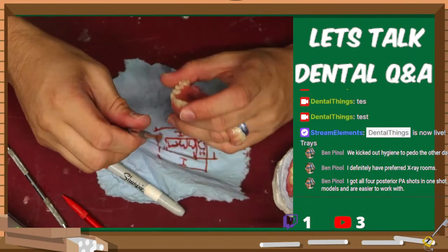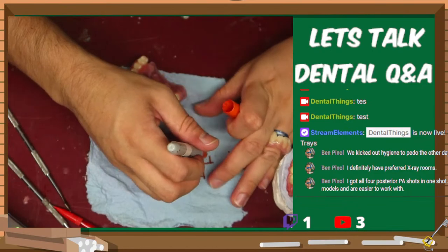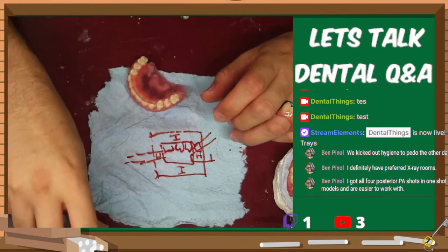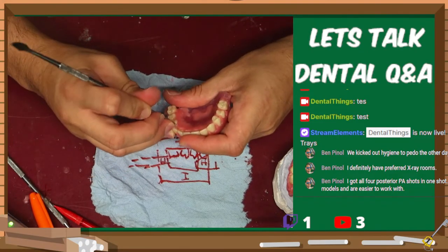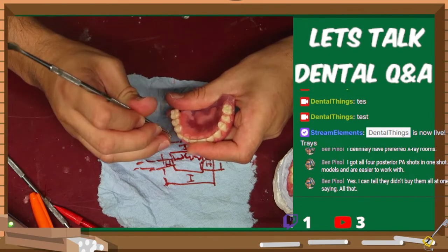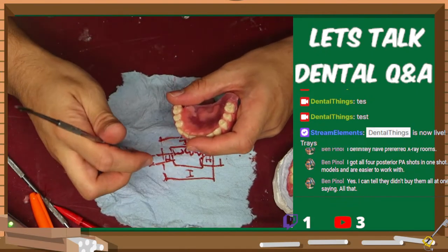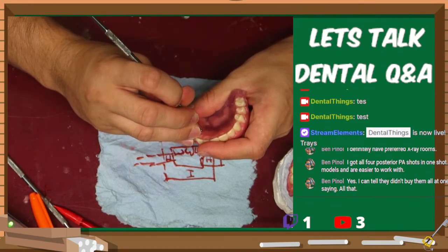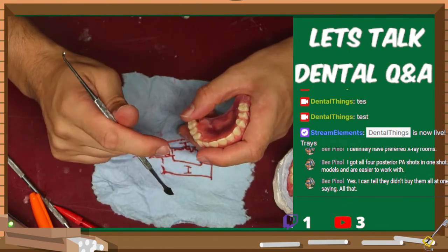And even sometimes just the direction that the wire is facing, because not all of them come straight out the back. Some of them come out at a little bit of an angle, and that makes it easier to grab on with your snap array sometimes. Yeah, I can tell they didn't buy them all at one time. Yep, usually that's the pains of the office. Let's just get one, let's test it out. If it's crappy, we'll just keep using it and we'll buy another one and see if that one works well.